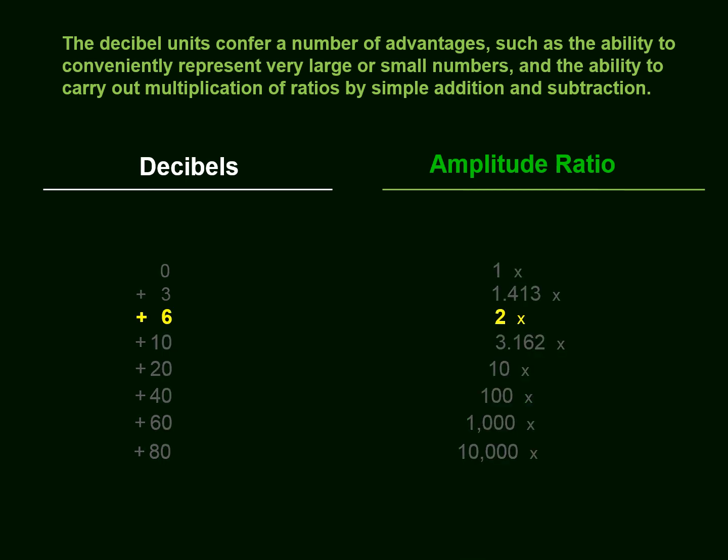There is one number that we should remember. A plus 6 decibel means an amplification to double the amount.